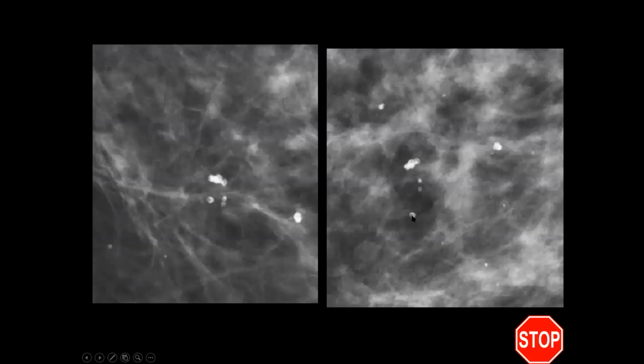These are the round, right? We said things that are round and don't look irregular are benign. We see the lucent center, how they kind of look like Cheerios. I don't know, for those of you that have children, I think I've seen my share of Cheerios when my daughter was a toddler, and they kind of look like that. And these are in the skin, and they're benign. Coarse heterogeneous, I would expect them to be more irregular.